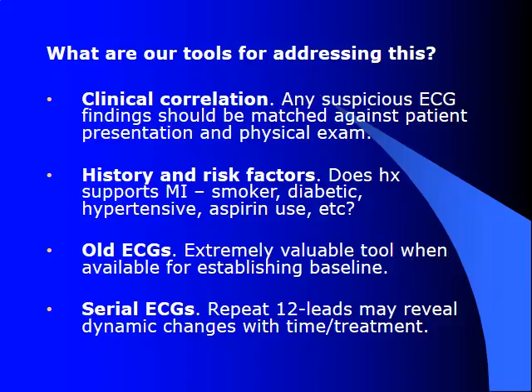And also, serial EKGs are very important. Repeat 12 leads are going to reveal dynamic changes with our times and treatments. We need to be able to see these changes. Seeing the changes happen real time with our treatments and as time moves on during transport will be a very key indicator in supporting our diagnosis.